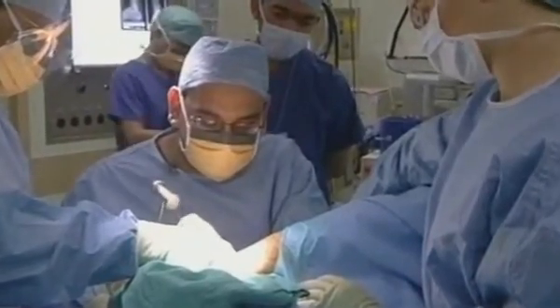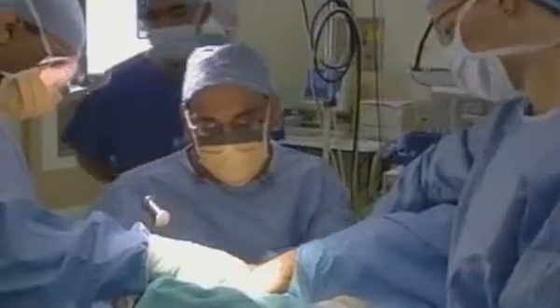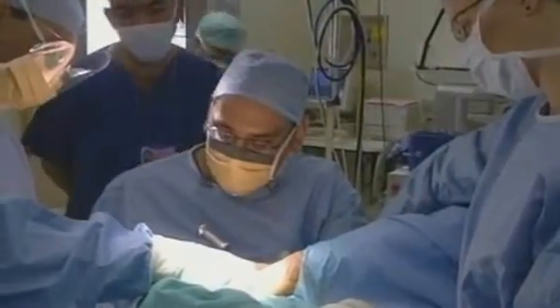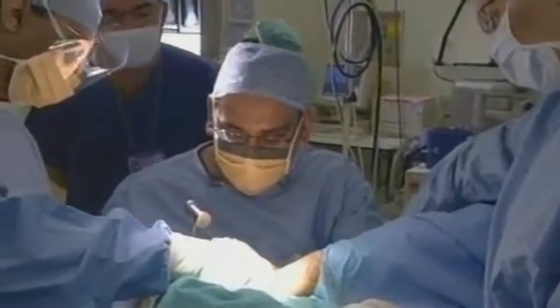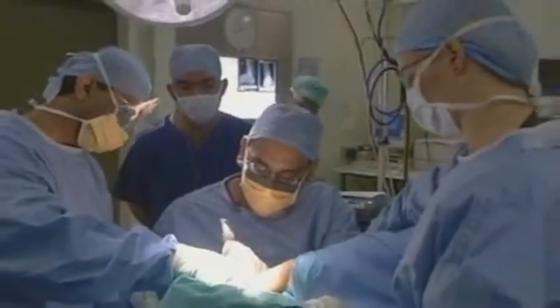What you'll see now is that the tendon is back in the groove. I've managed to push that bone in and very nicely deepen the groove. Can you see that, Neerav? Yeah, you've not seen this before either. OK, so if we pop back in a couple of minutes, you'll be able to... Yeah, certainly. Simon, well, thank you very much for now, Mr. Singh.